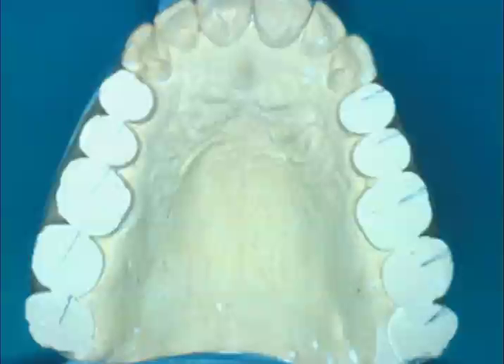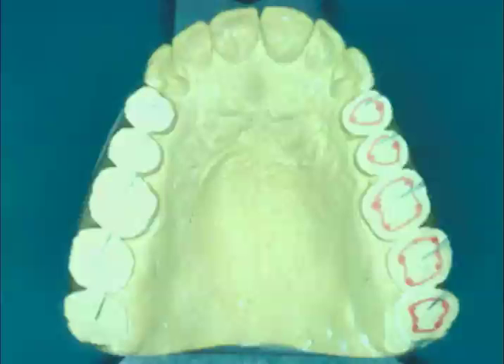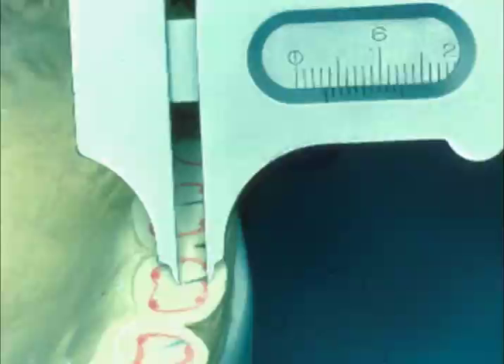We can now see the three lines, and as we look on the working side, as we move towards the back of the mouth, we can see a separation in the lines. But again, he ground down these teeth, which made them much wider. So if we draw back in where the top of the tooth is, I can't see how you can wax the difference between small, medium, and large within the functional range of the top of the tooth. Just to show we didn't go less than the 3 millimeter functional range, here we're showing 3.5 millimeters.